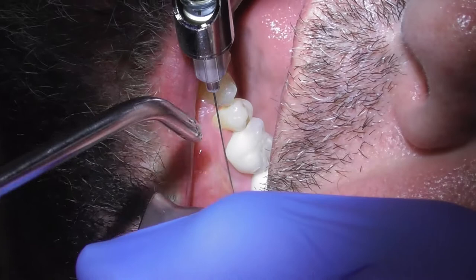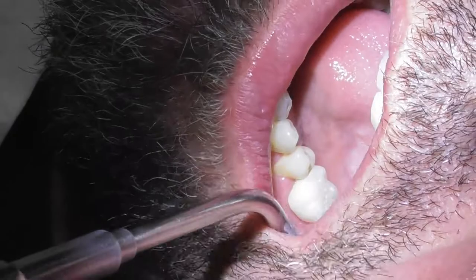All the local does obviously gets you numb, but it's also going to make the procedure a little bit easier. We like to use the fancy word — it's called hydro-dissection. By putting the local in there, the fluid just helps push the tissue back as well and makes it numb.